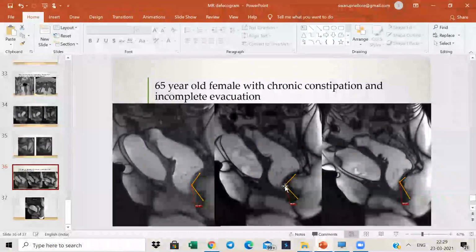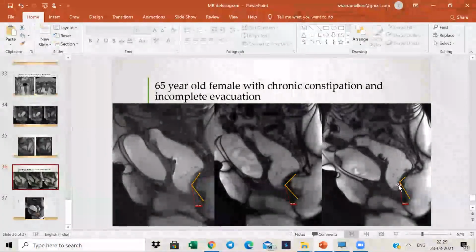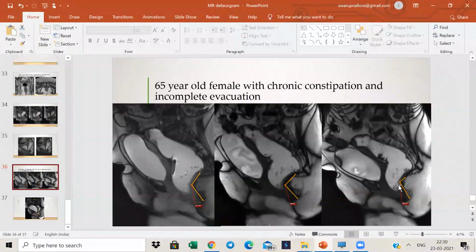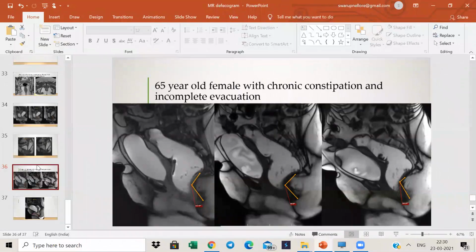So if you look at it, this is the anorectal junction on this image and on this image as well. On the defecation phase, obviously, because the angle gets straightened out, you might not really be able to appreciate the anorectal junction very clearly. But that really is not so important in those situations, because there you are not so concerned about that. You're looking for other secondary signs of any kind of pelvic organ prolapse. I hope that answers the question.